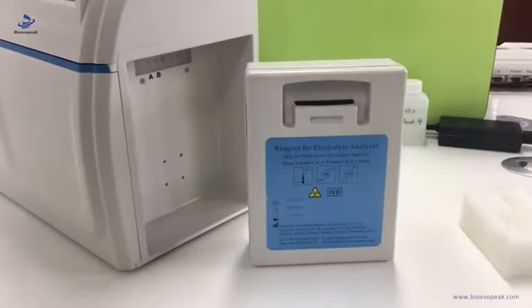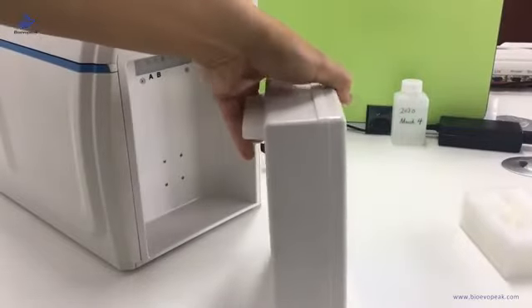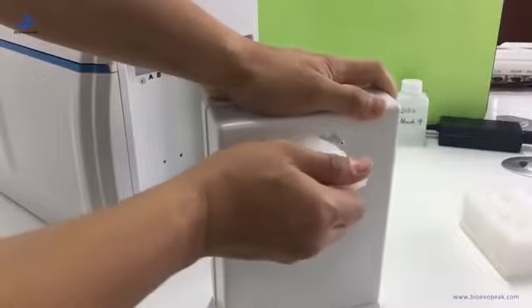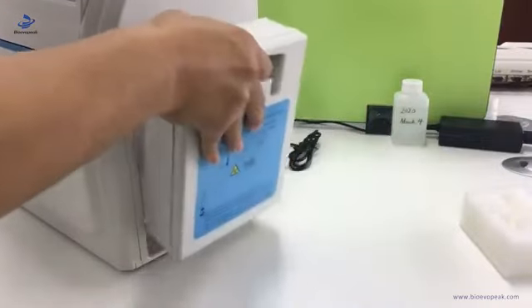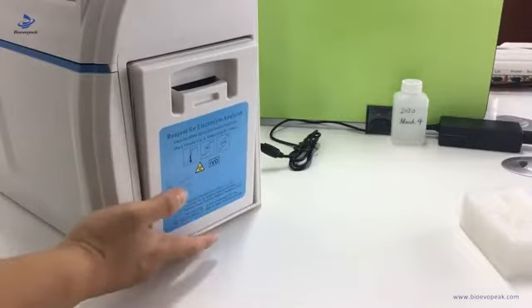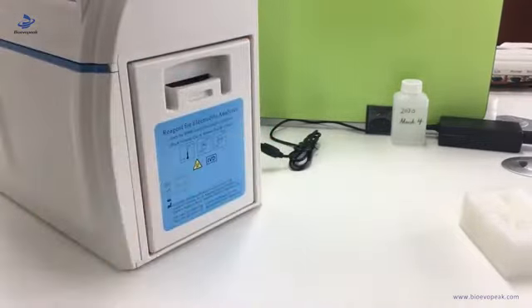Now let's install the reagent pack. First we need to remove the rubber of the reagent pack, then put it at the position — let the bottom sit at the position first, then push the head, and it is set.